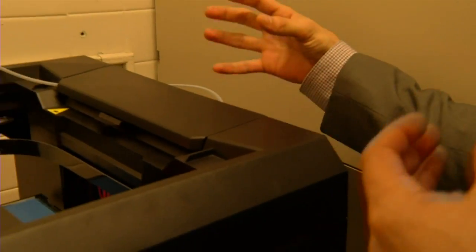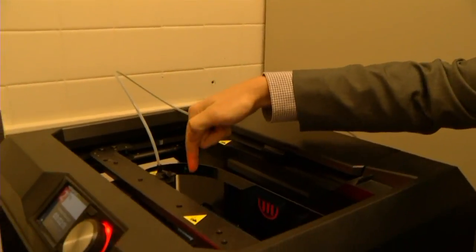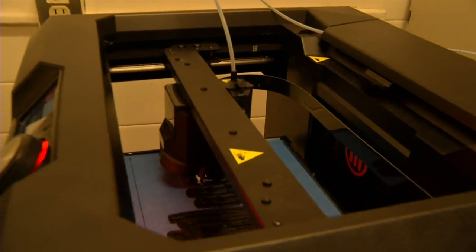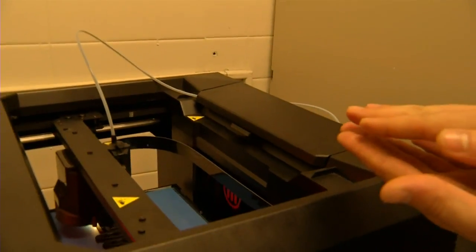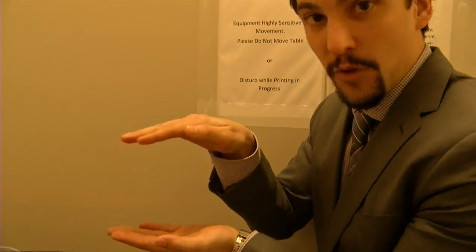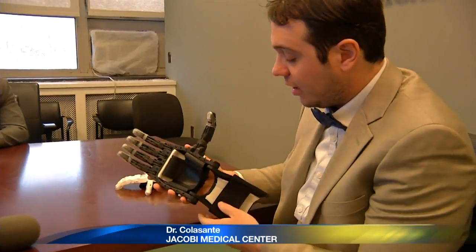What you have back here is a spool of PLA plastic, which is very strong. It runs through here into an extruder that heats and melts the plastic, putting down a thin two-dimensional layer. That layer hardens, and then the printer comes back and puts down another two-dimensional layer. You keep building thin layers on top of each other until you have a 3D construct.